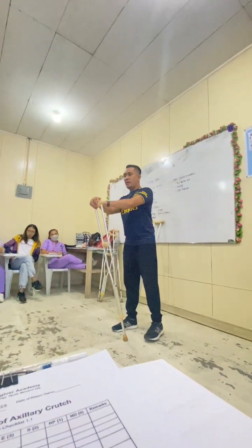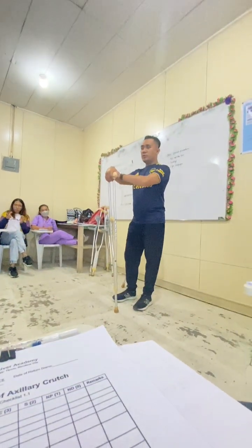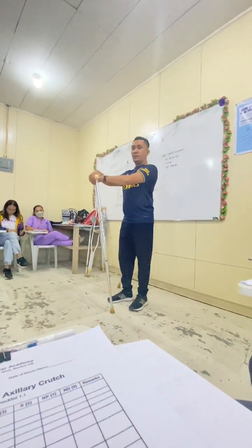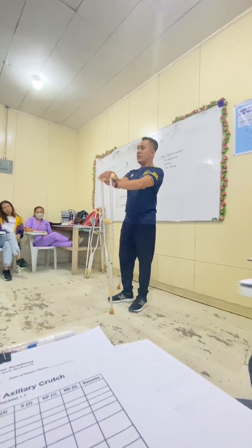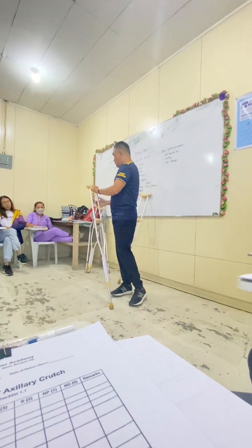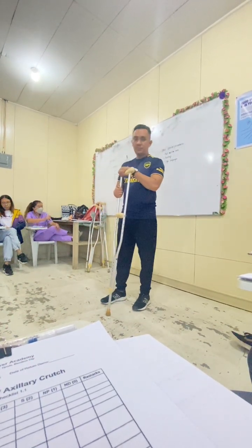Okay, na rapport gamay. After introducing yourself, explain the procedure. So you will talk to your client. Ma'am, nanay ko din karon, so that I'll be assisting you in fitting the axillary crutches. At the same time, probably teach how to walk. Okay? Next is, identify if you have the correct patient.